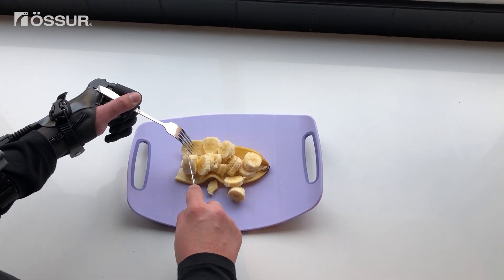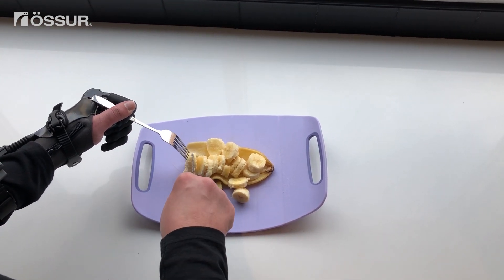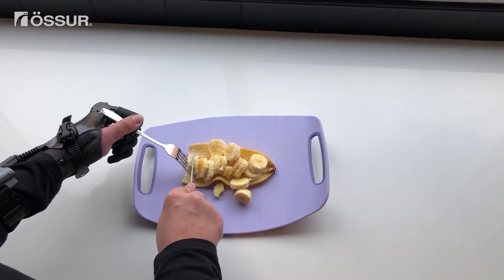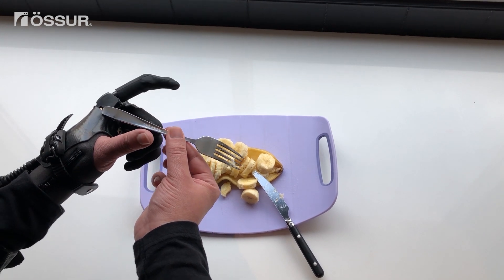Once finished cutting, send a signal to release the knife from your grasp. Note that this cutting method could also work for cutting hot dogs, cucumbers, sushi rolls, and more.